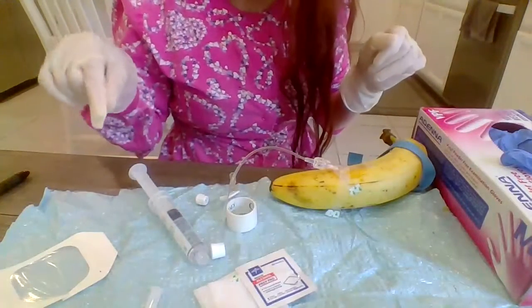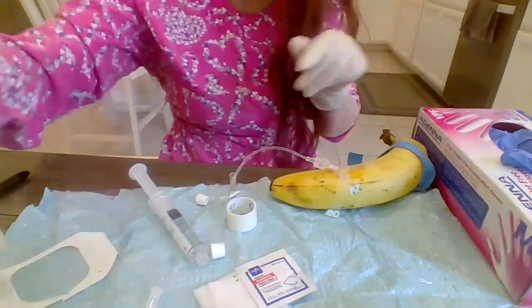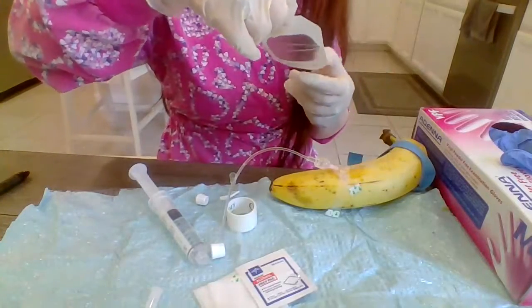Now I'm going to go ahead and put the Tegaderm on top.